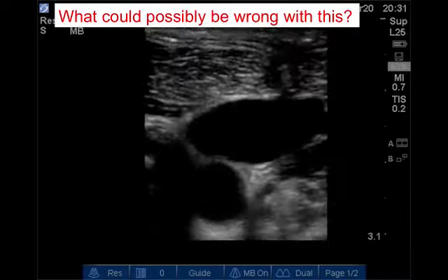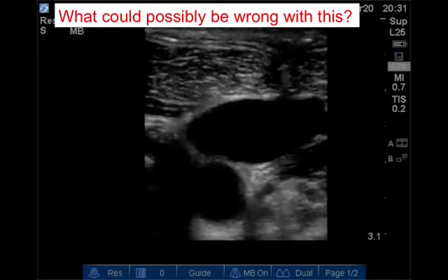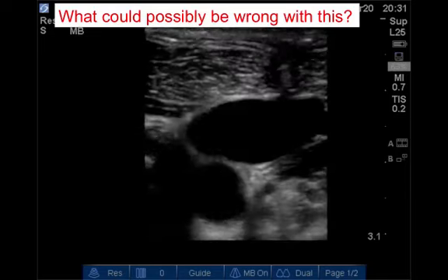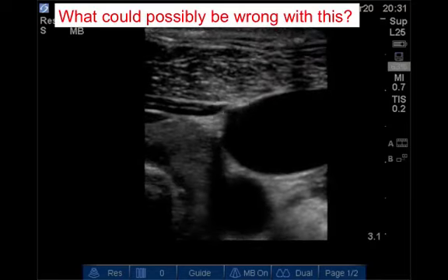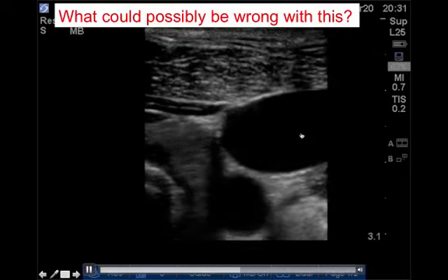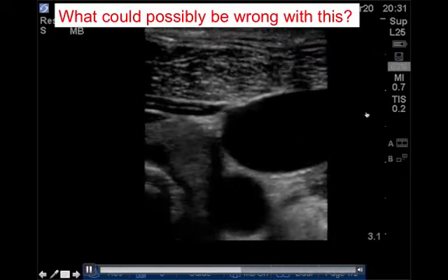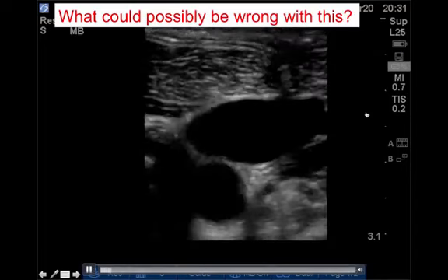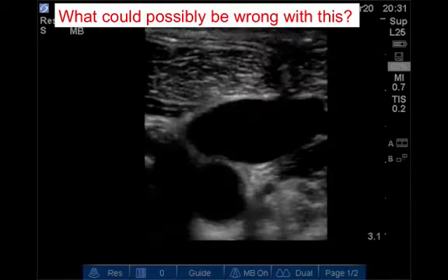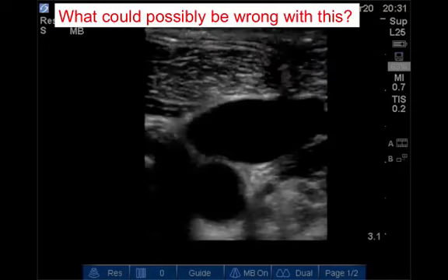More on this later. So I expect many of you have done ultrasound-guided access, and I think it's important to recognize that many of you, I expect, will have done it in this approach, where you have a nice image of the carotid and the IJ here, and you can see tissue wiggling, but you see either no evidence of needle tip, as is in this case, or often what you might mistake for the tip that is not actually the tip. And that comes back to the creep technique, which we'll talk about in a little bit.